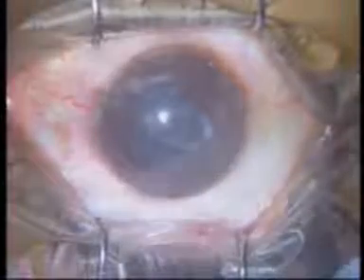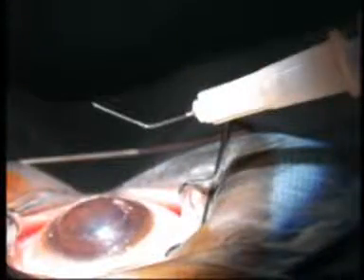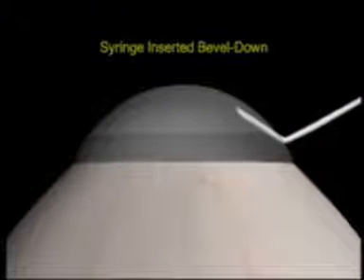As can be seen in this video, partial thickness trefination is achieved using a simple trephine. If the groove is not deep enough, it can be manually deepened. A 30-gauge needle, bent 5mm from its tip and angulated at 60 degrees, is attached to an air-filled syringe and inserted beveled down into the corneal stroma at its chosen site, deep in the trefination groove.